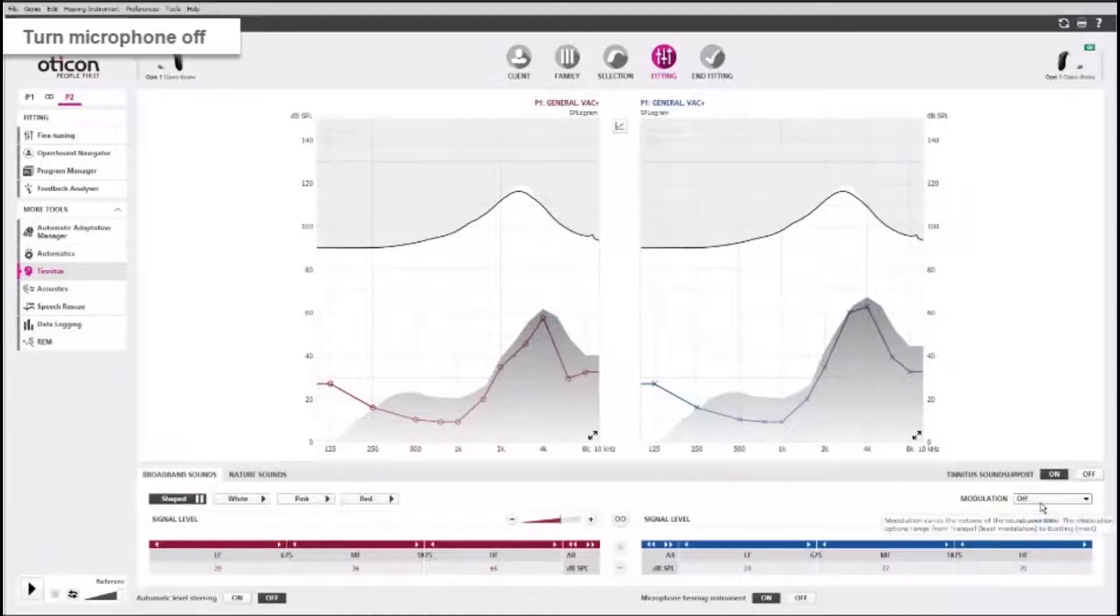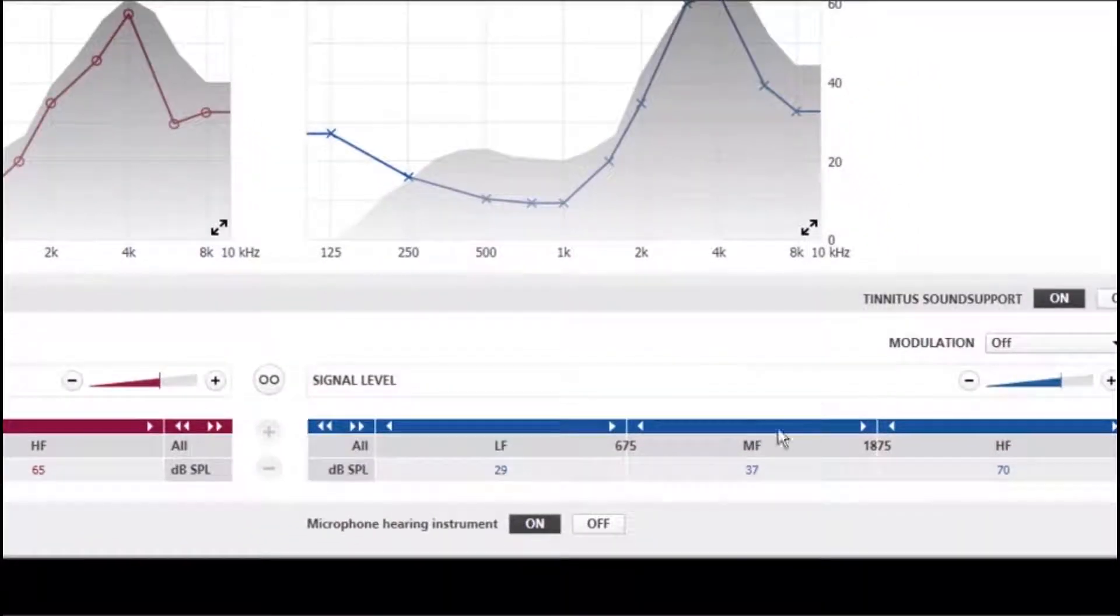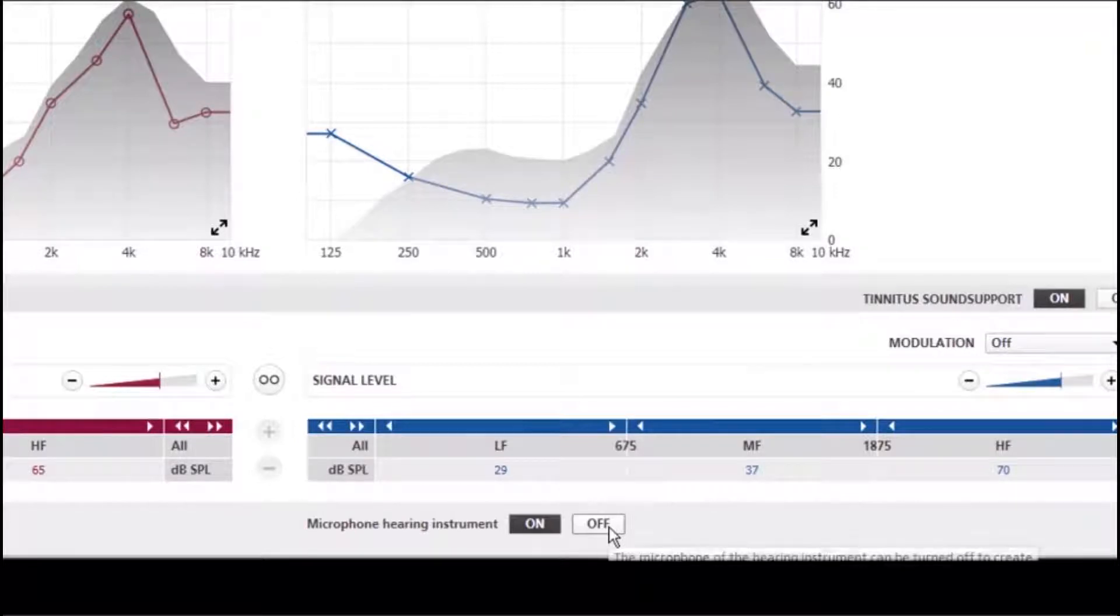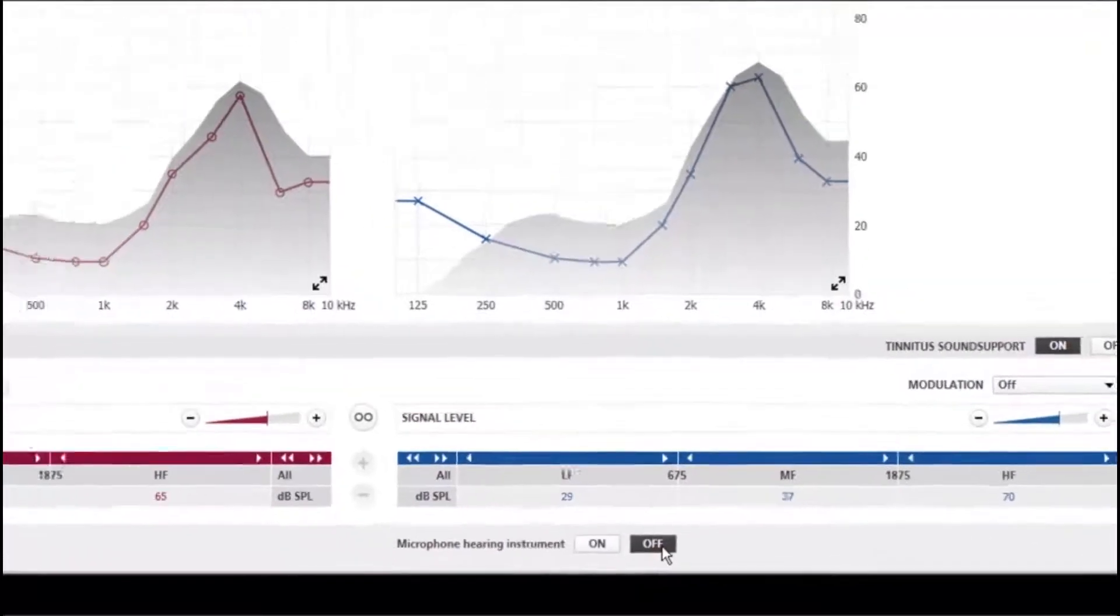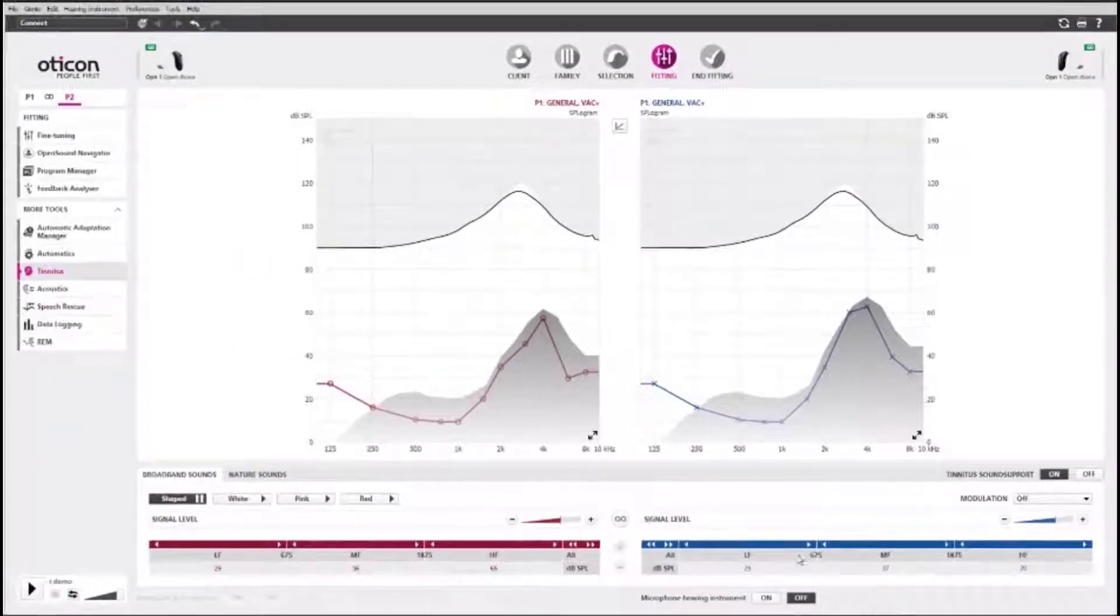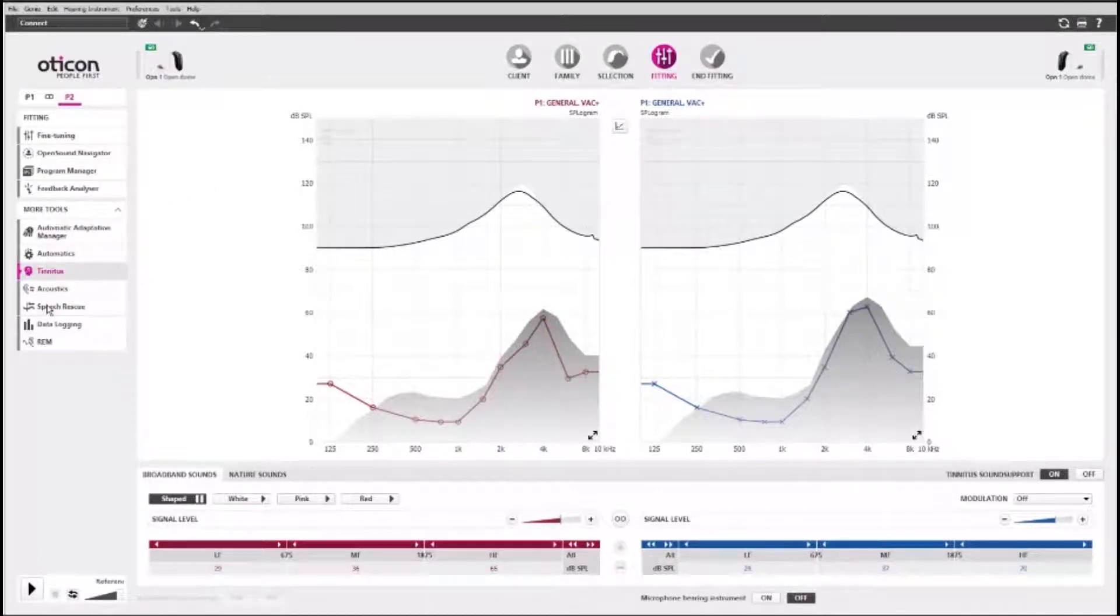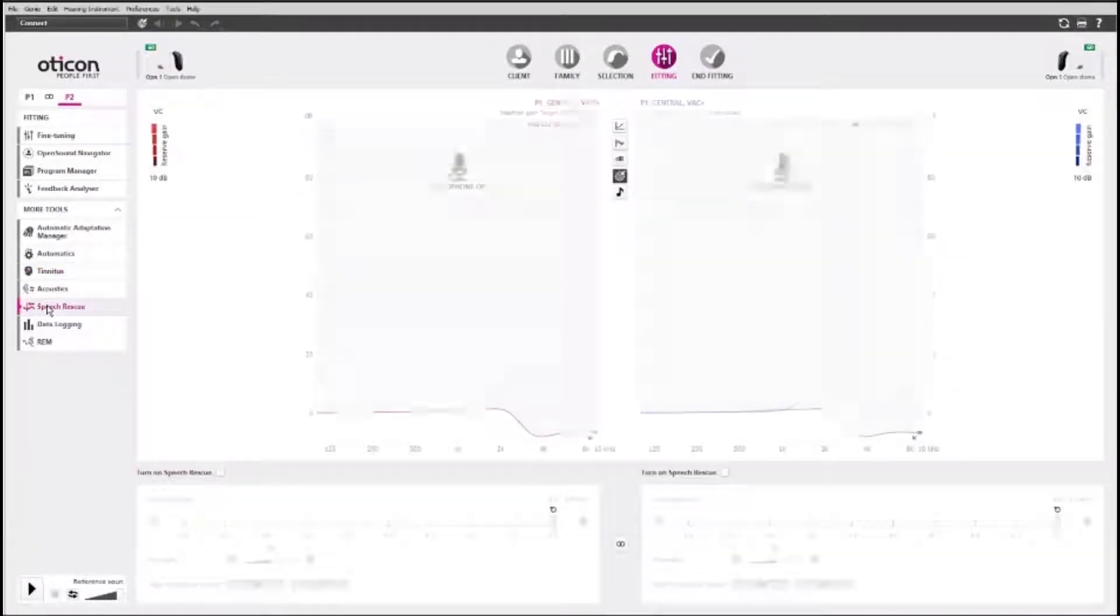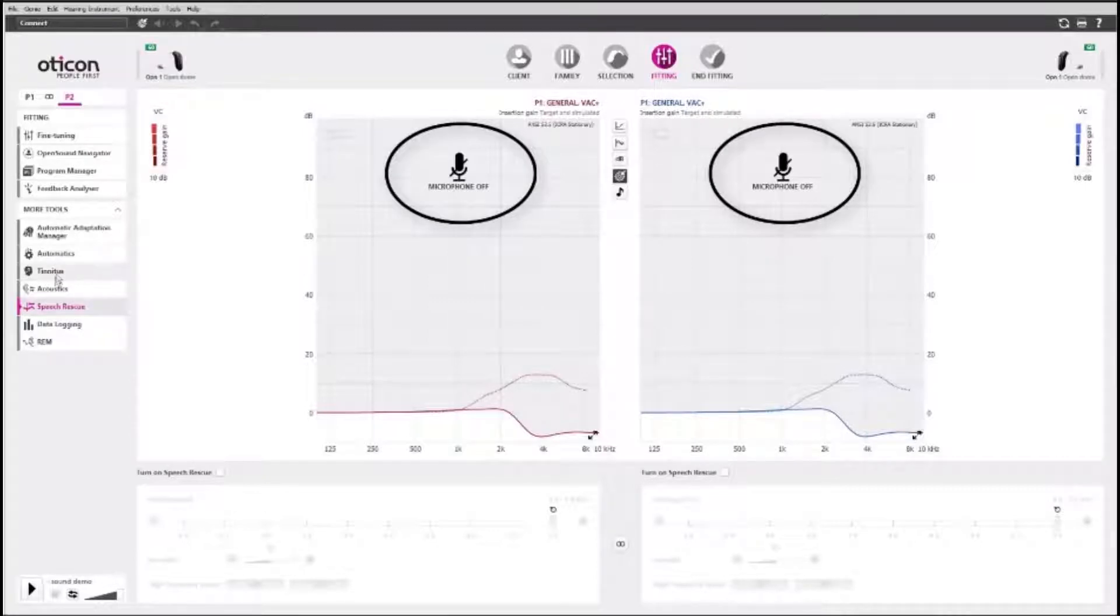The microphone in the hearing aid is turned on by default. Turn off the microphone if you want to offer a program with Tinnitus Sound Support only. If you turn the microphone off, you will be made aware of this if you leave the Tinnitus Tool and go to another tool.